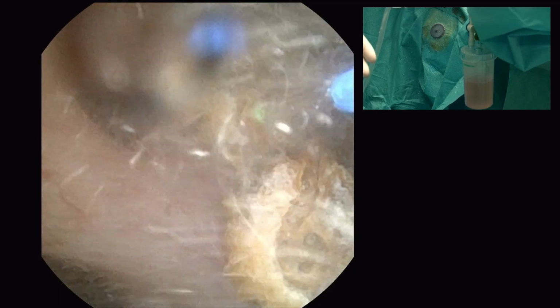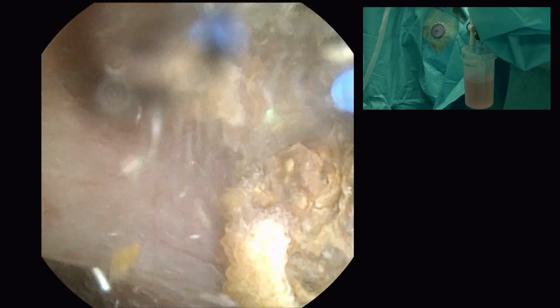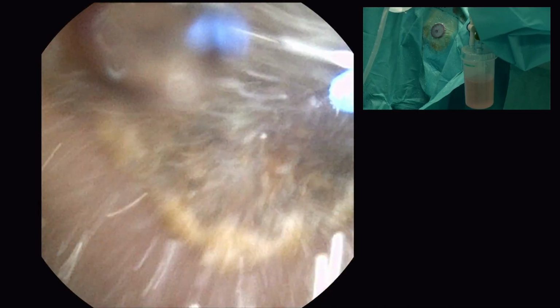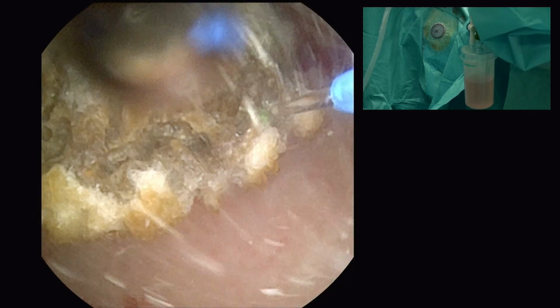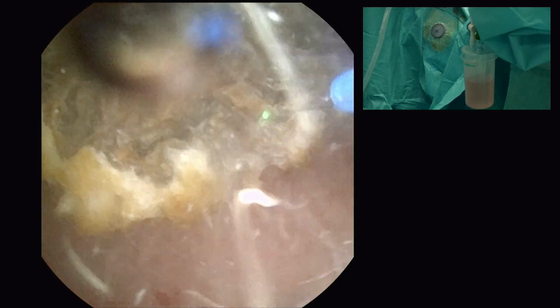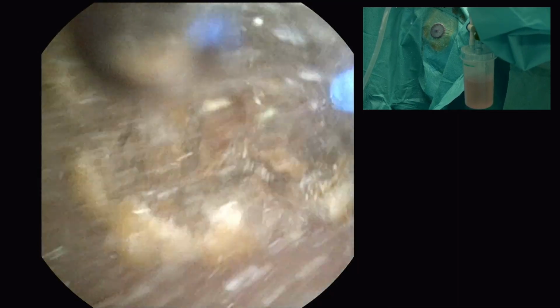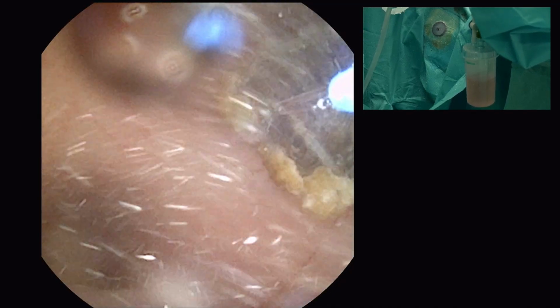Especially with diverticular stones, they are very difficult, where you have a very small space. At that time, it's very difficult. My anesthetists love to do it in spinal. They give us spinal and they're out of the OT. Short procedures can be done, but spinal would be slightly difficult, especially here. Because a second thing, once the irrigation is going on, there is always a chance that the patient will feel the pain.